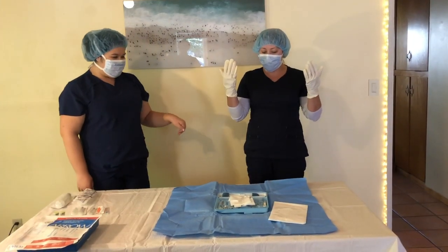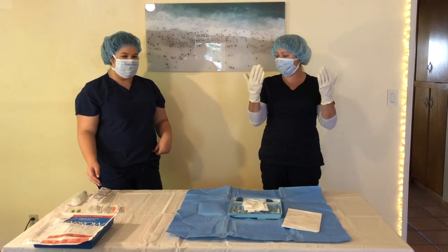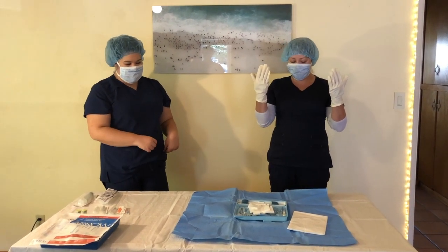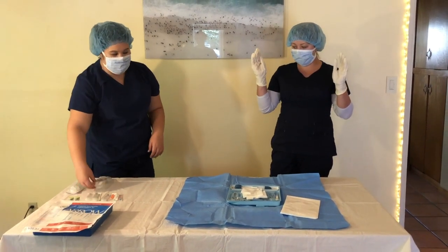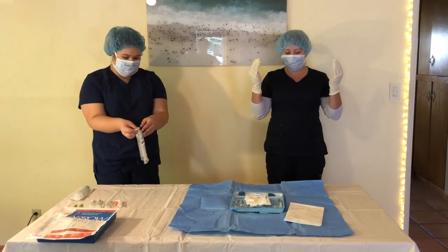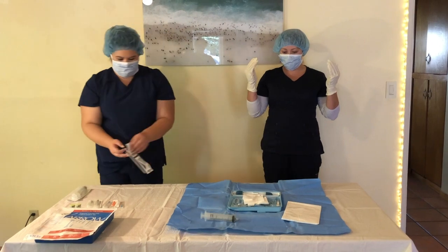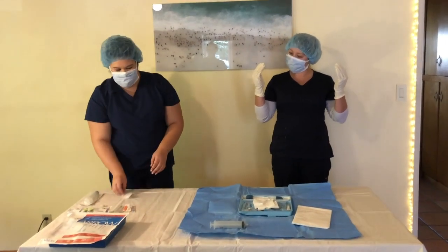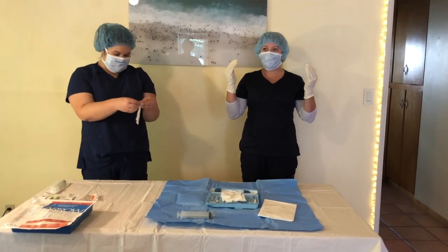So Tegan is now the sterile person, and I'm going to drop the extra things that we need onto the sterile field, and Tegan's going to organize our sterile field. You want to open the objects away from your body and drop them onto the sterile field without touching anything. Try not to make them bounce like that.